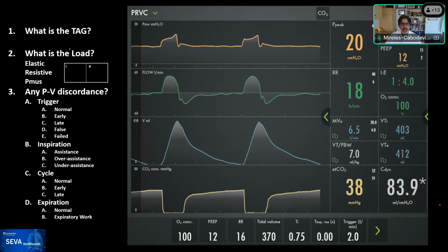And so I'll start just by highlighting that the goal for this patient is safety. And so I'll put it up here just for everybody to be aware. This is a patient with severe hypoxic respiratory failure post a brief cardiac arrest with multiple other issues going on. But I hope that gives you just an idea of where we are in the care of this patient.